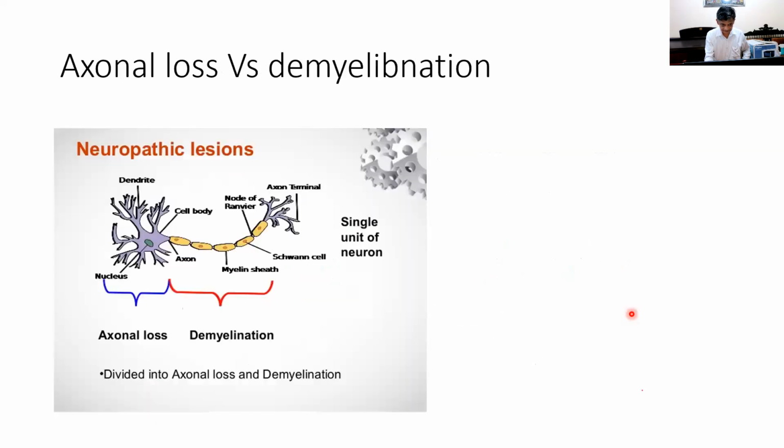Okay. And then a few words about nerve damage. Actually, ENG can be used to study patients with cut injuries.